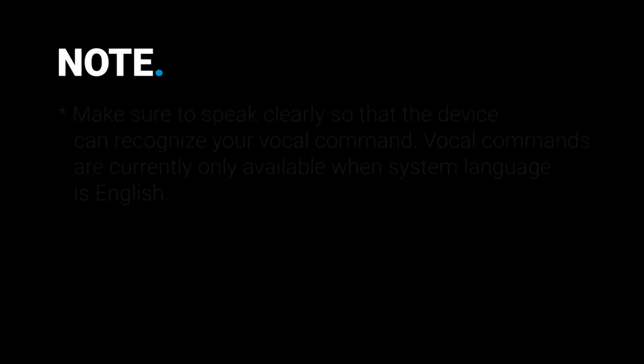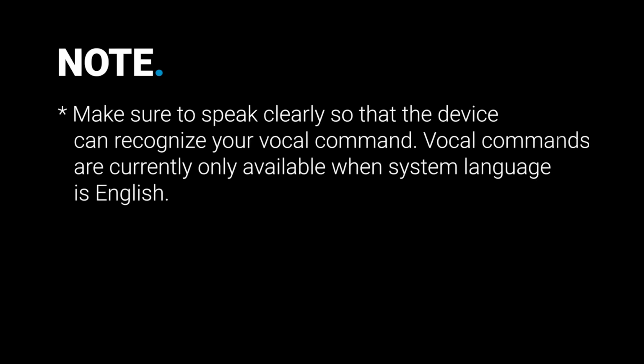Note: make sure to speak clearly so the device can recognize your vocal command. Vocal commands are currently only available when system language is English.